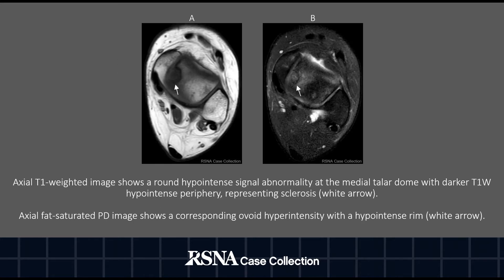On the axial T1-weighted image on the left, there is a round hypo-intense signal abnormality at the medial talar dome with a darker T1-weighted hypo-intense periphery representing sclerosis. On the axial fat-saturated PD image on the right, there is a corresponding ovoid hyperintensity with a hypo-intense rim.